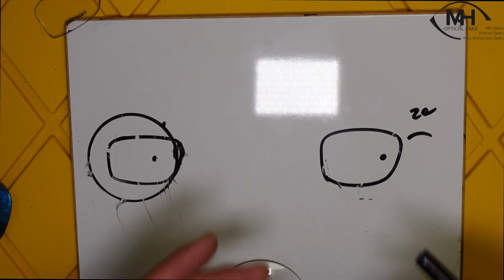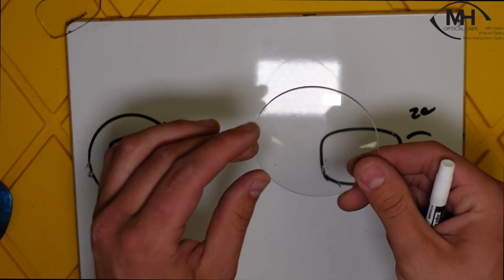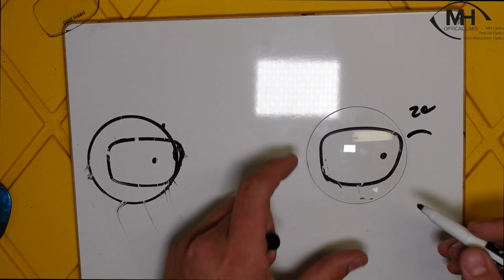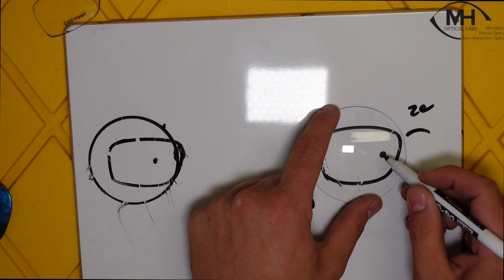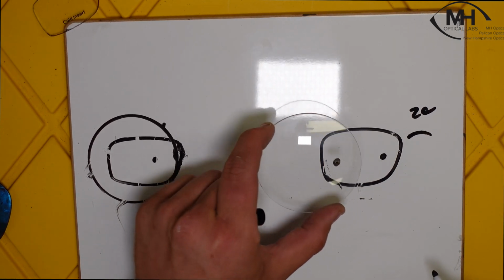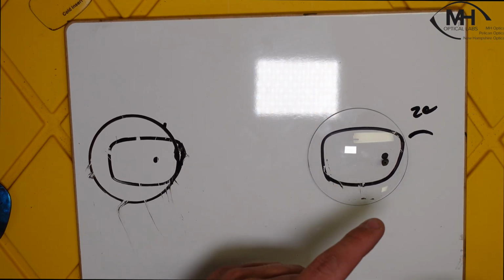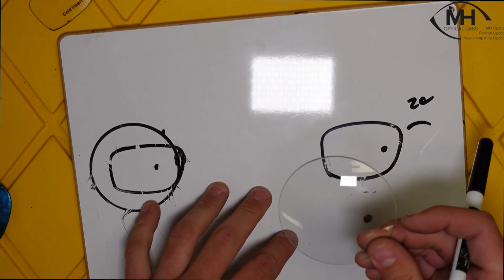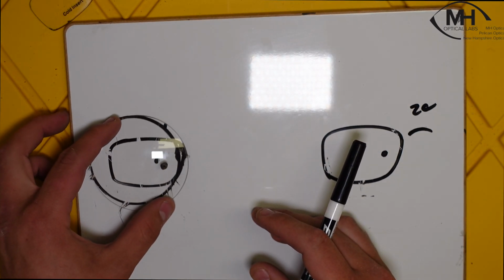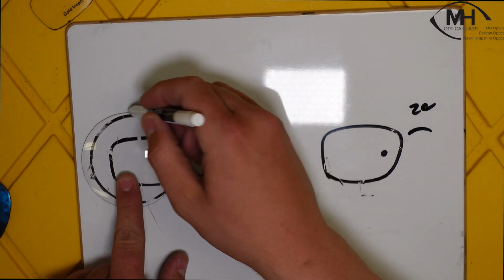Let's say you do give bigger frame measurements than you did before. So now let's say we do achieve a bigger blank. We'll represent this as a bigger blank, okay, which it is, it's a 75 millimeter. However, that PD is still the same in that frame, in a big frame now. Okay, so now we still have this weird OC that's generated all the way over there, and I see this quite a bit. So now you get a bigger blank, you see it, you're gonna say, oh good, this is gonna cut out, but then here's what's gonna happen. The same thing, and you're still missing.